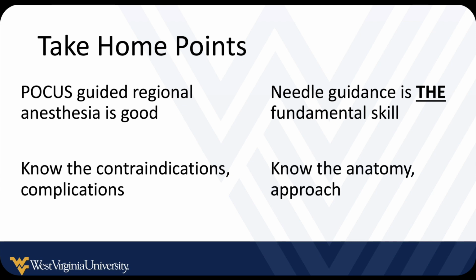And then with certain blocks, it's always good, especially if you haven't done whatever block you're considering in a while, to refresh yourself on the distribution of expected anesthesia, the anatomy, and the approach. And again, if you can refresh yourself on that and you are skilled at guiding your needle, this is something you can readily incorporate into your practice. Further emphasis: needle guidance, fundamental skills. So make sure you feel comfortable with that and you're good at that.